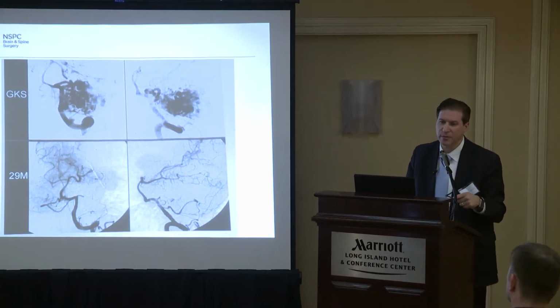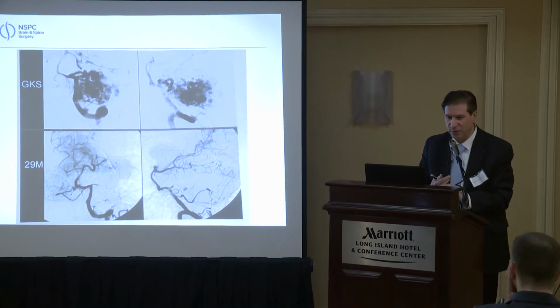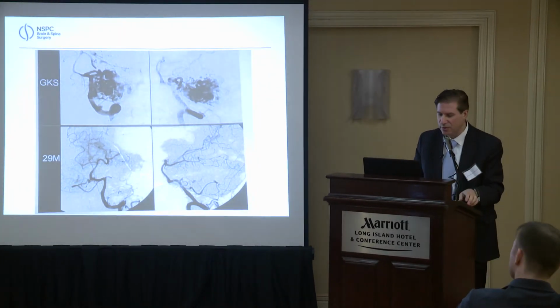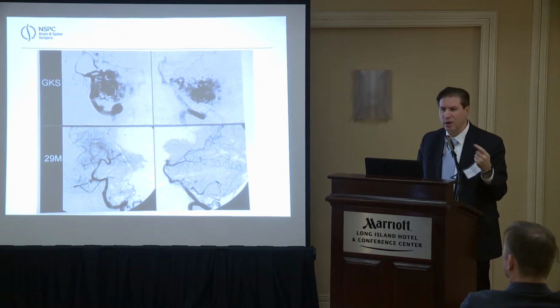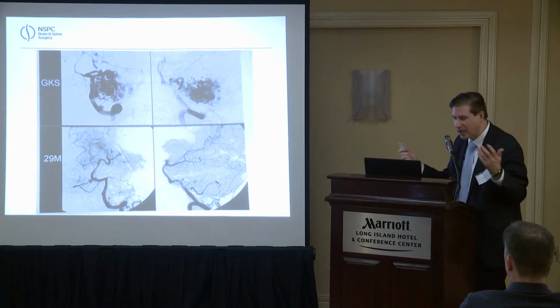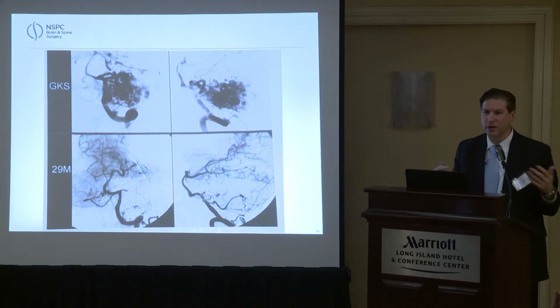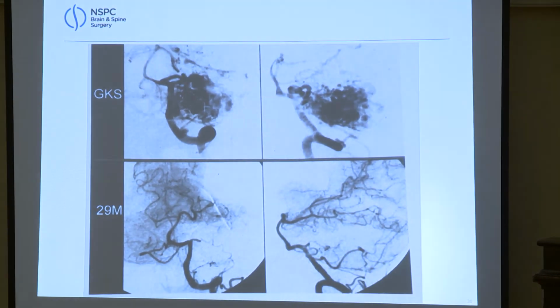If you treat the AVM and it's gone completely, often the seizures will go away. Often the risk of bleeding can go to 0, and often the associated aneurysms will go away as well. These are high risk to remove. Also, I think right after a bleed of a standard brain AVM, it's about 6% the first year after a bleed, then goes back to 3%. Gamma Knife, magically, when aimed at the abnormal blood vessels of an AVM, causes them to thrombose and no longer be a risk for bleeding.